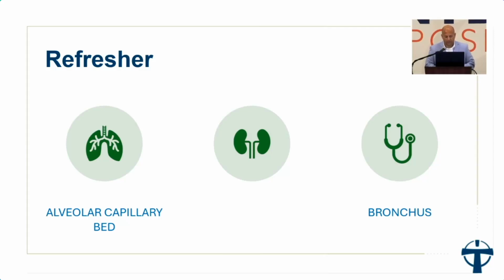Just a reminder, when we're trying to ventilate these patients on ECMO or even not on ECMO, make sure that PEEP is right for that patient. Not every patient is the same. We've got to remember, is there some kind of congenital anomaly with the patient? Is there something else going on where we may need higher PEEP or lower PEEP?